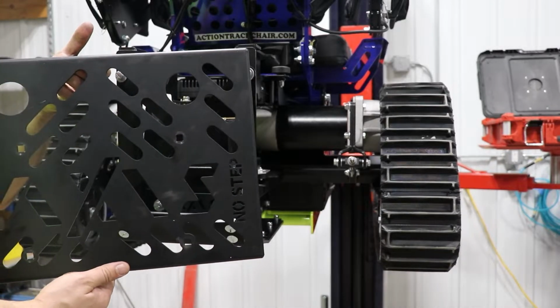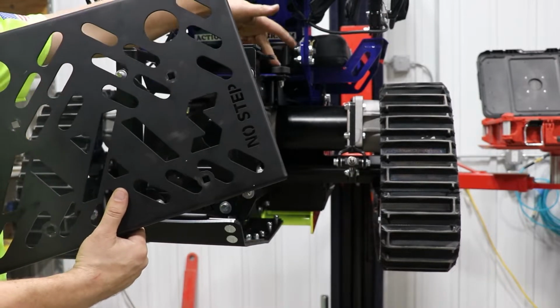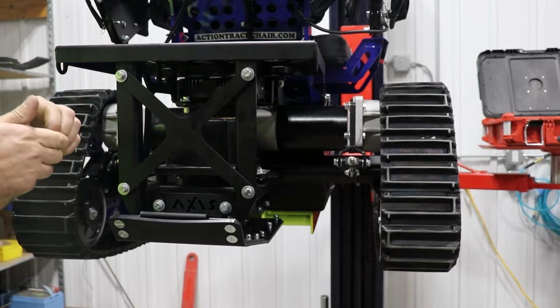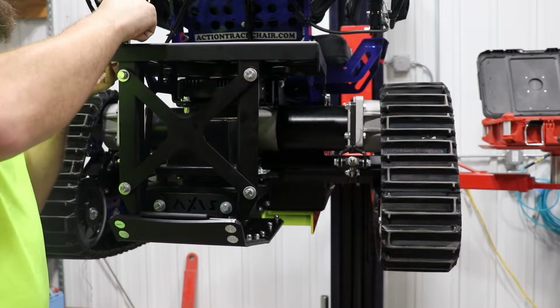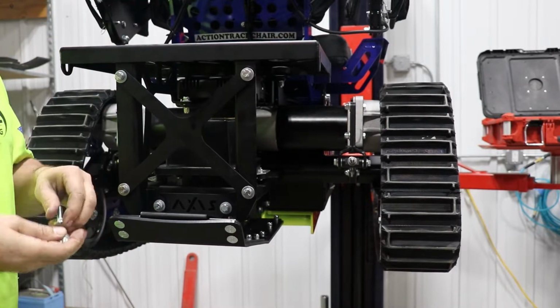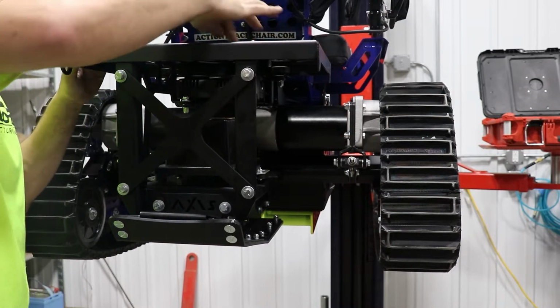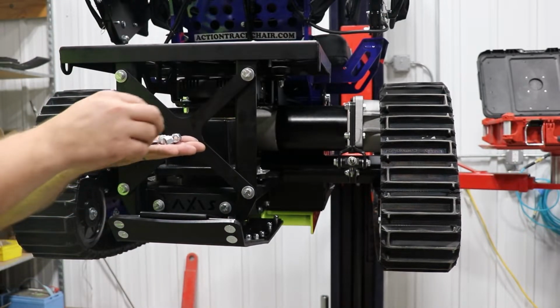Next step, take the pan. You'll see there's round holes right here. They go to the front for this thumb screw. Carriage bolts. Washers on the bottom, nylock nut.